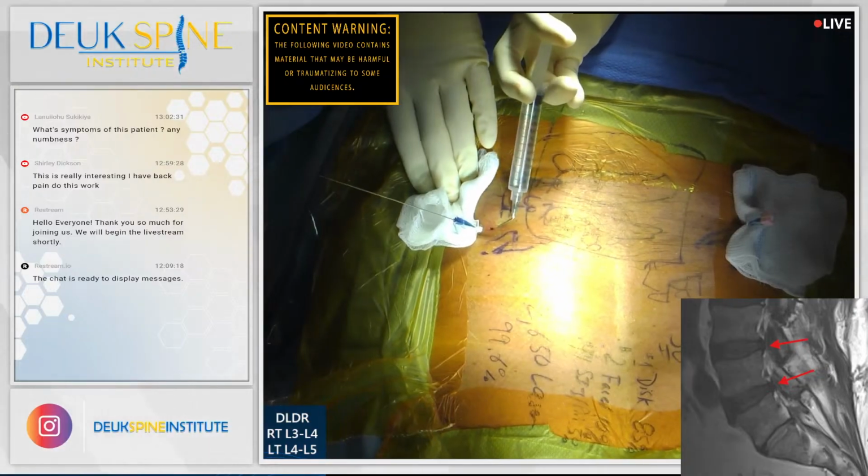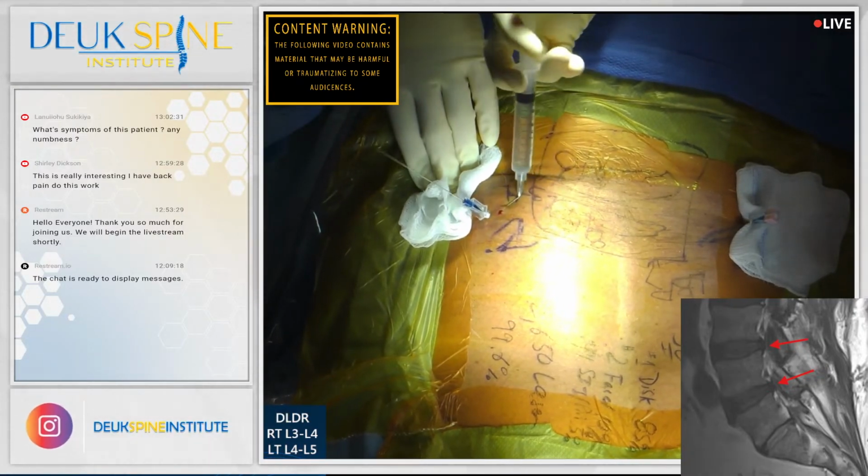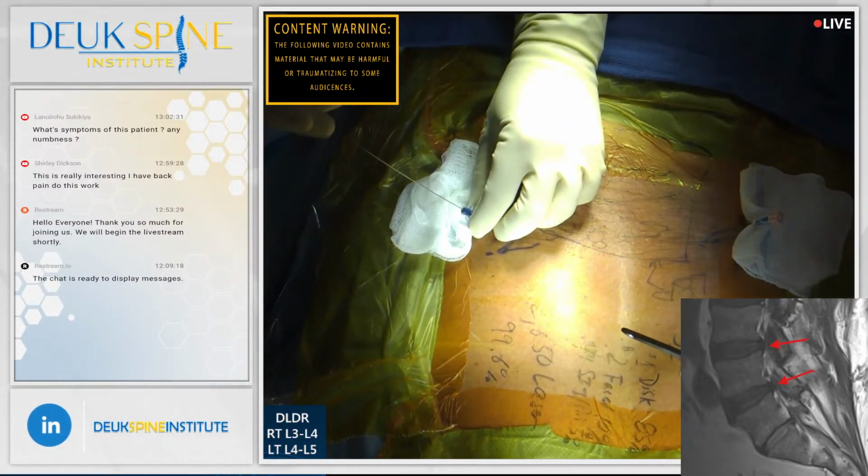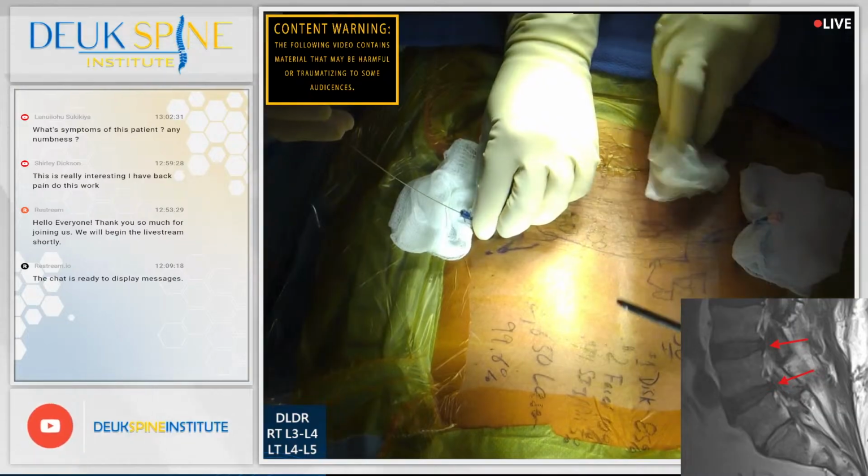We're going to start on the right side. We're going to fix the L3-4. Any questions from our audience? Yes, we have about 2 questions. The first one is coming from Shirley on YouTube.